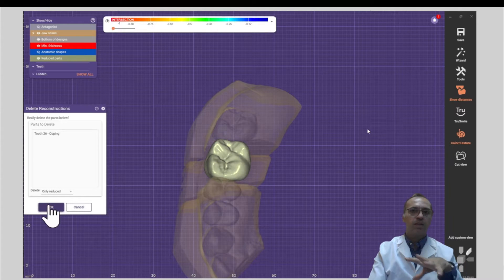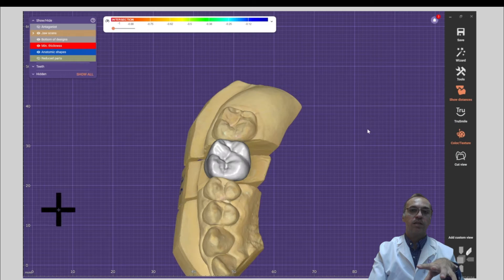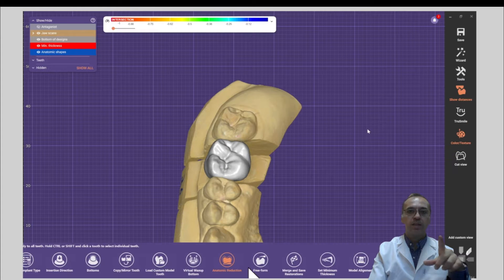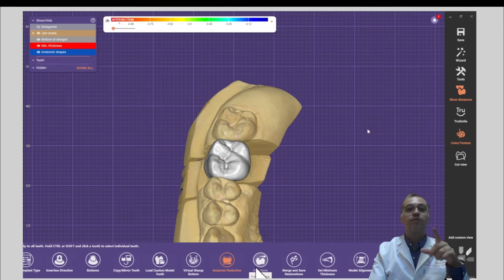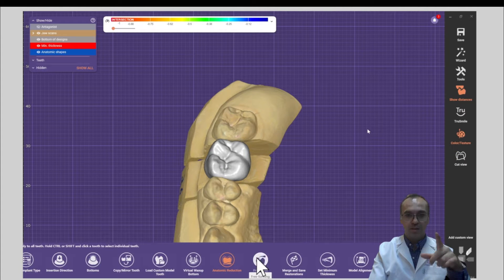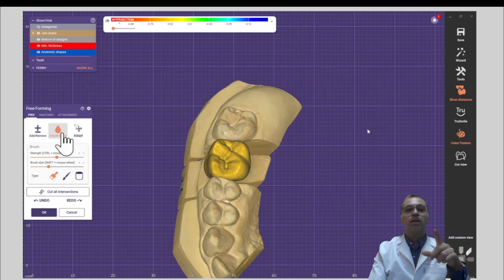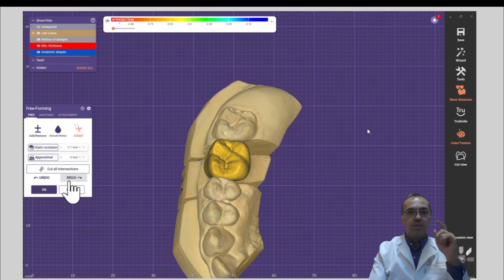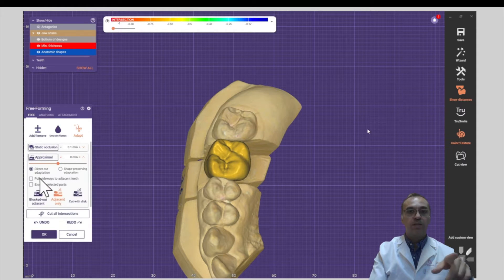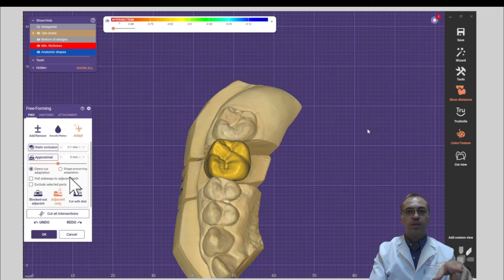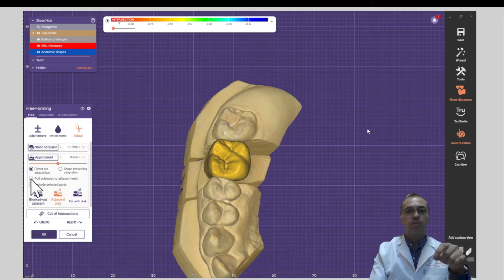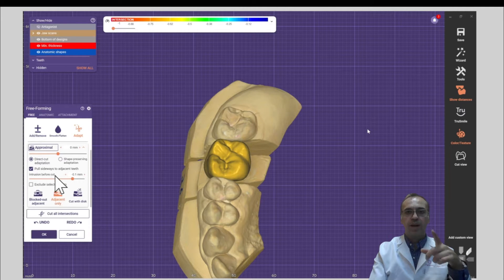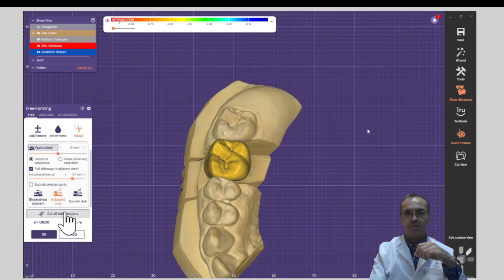First of all, I delete the reduced part and then I'm going for freeform. Now I'm going to adapt an approximal. Open it, tick this, pull sideways to adjacent. And look, the magic happens.